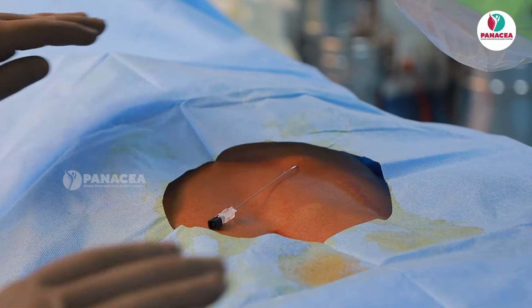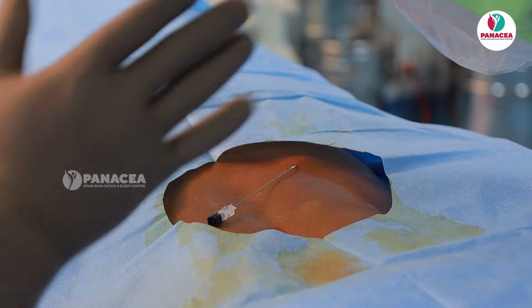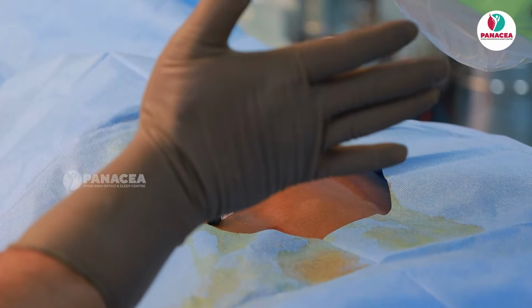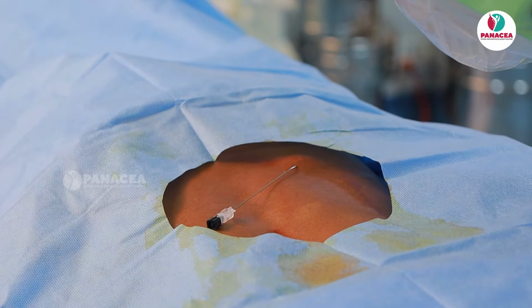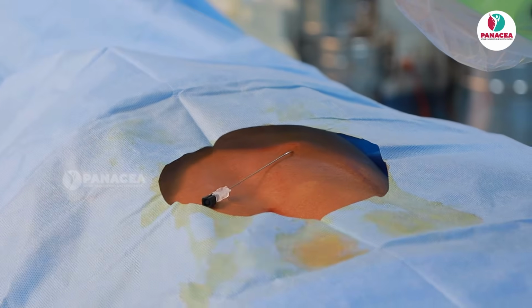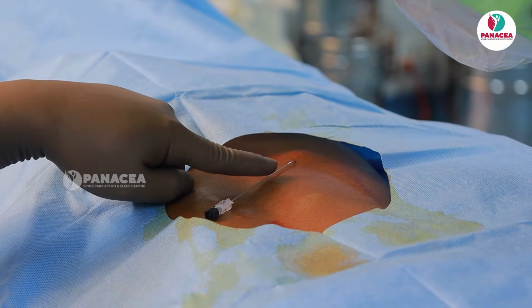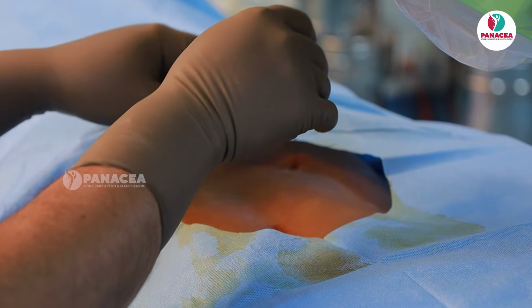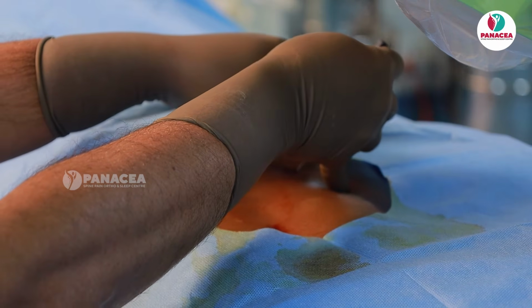This is the cephalad end, this is the caudal end, that is the left side of the patient, this is the right side of the patient. Fluoroscopy at 30 degrees oblique and tilted 5 degrees cephalad, and we have placed a 22 gauge Quincke needle. The tip is bent to the bevel end side. Now I am placing my index finger here and lifting the needle after giving local infiltration, and my guide is the fluoro.